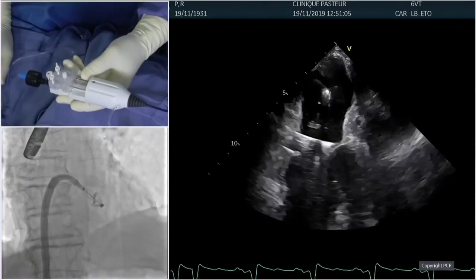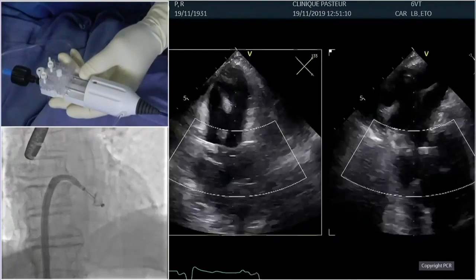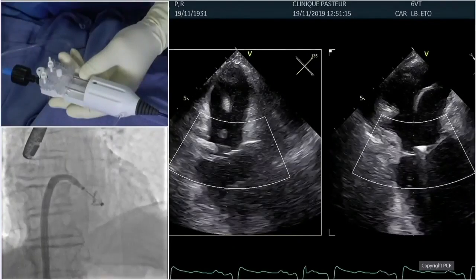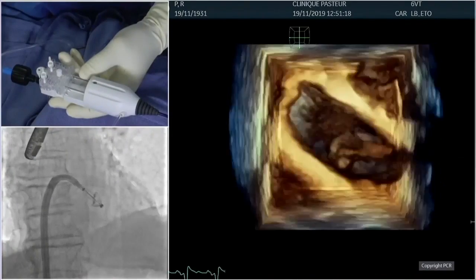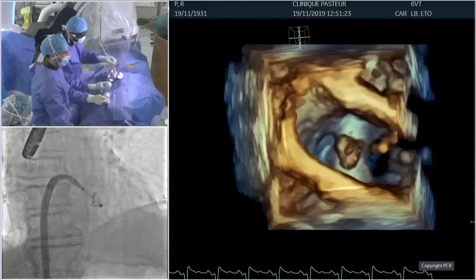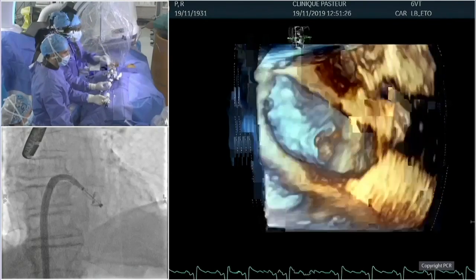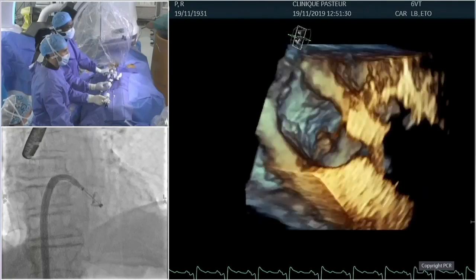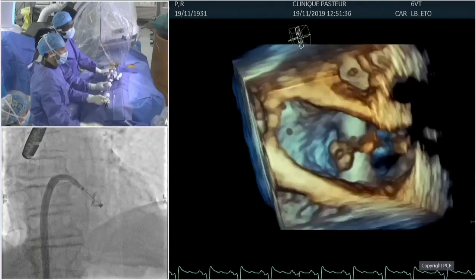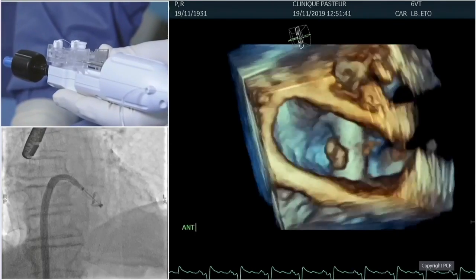So maybe Laurent, you could show us the 3D fast view, and we're going to show once again the movements of the clasp, and whether we need to correct the perpendicularity of the IC, and then go for the capture. Meanwhile, if you have any comments, please feel free. Just explain what we're looking at on this 3D view. What is what? What's anterior, posterior, medial, lateral, and what are you aiming for with the device?